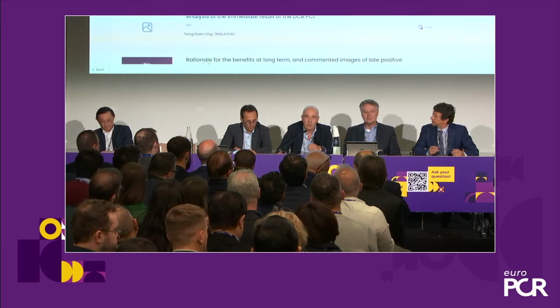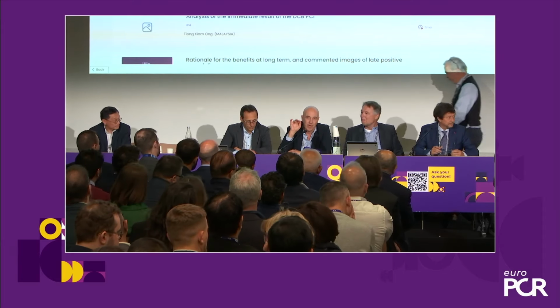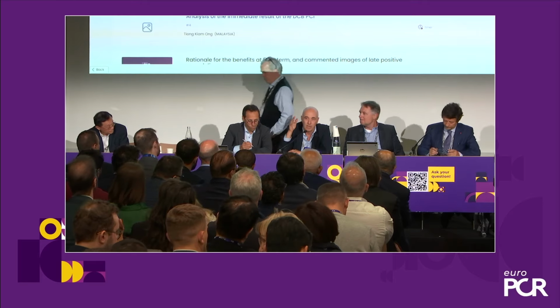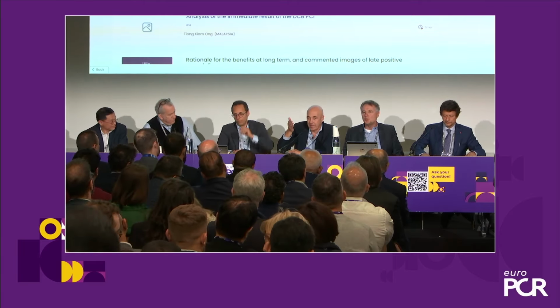I want to make a comment because this is a very crucial point. Following our experience in SFA, also in below-the-knee cases, of course, SFA is not coronary, so the risk of total occlusion is a completely different matter. But we were completely surprised because we made some very horrible angiographic final results using DCB, diffuse disease, diffuse dissection, and so on.